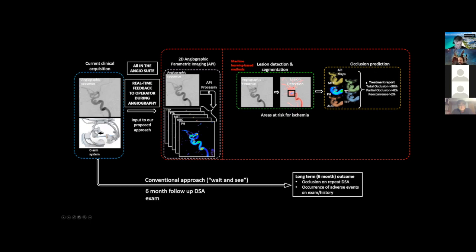The other thing I'm going to insist on at the end is: never ever use the AI to tell a surgeon a definite answer and say, this is going to occlude. No, just give likelihoods of things occurring. Because if the AI decides with 52% that this aneurysm is going to occlude, it is giving a definitive answer, and a 52% confidence in a prediction is not the same as 90% confidence. So it is good for us to break the AI down and show the surgeons how confident the software is, and display it in our interpretation of the data.